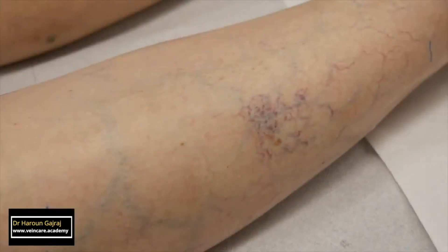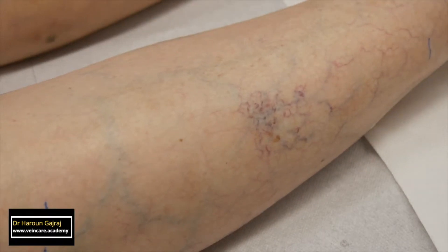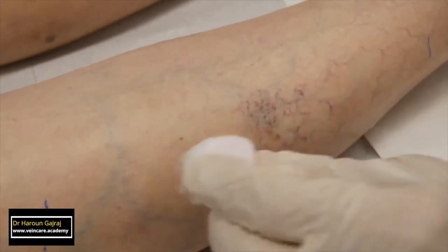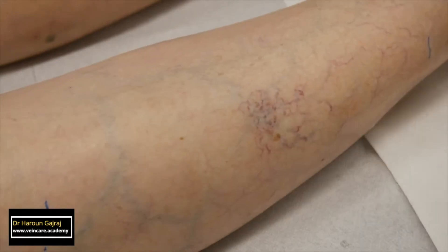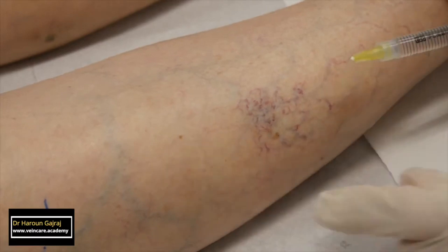Here we see a cluster of telangiectasia on the outer part of this patient's right calf. I am preparing to inject them. I disinfect the skin with an alcohol-based skin cleanser. Consider allowing a few seconds to allow the alcohol to dry completely, to minimise the discomfort of the injection.